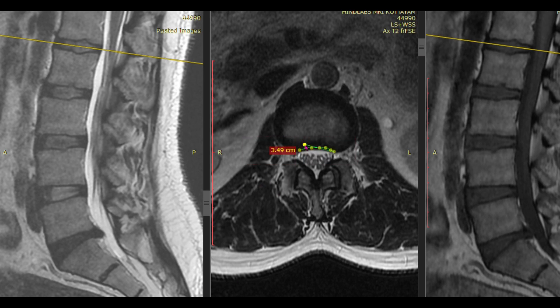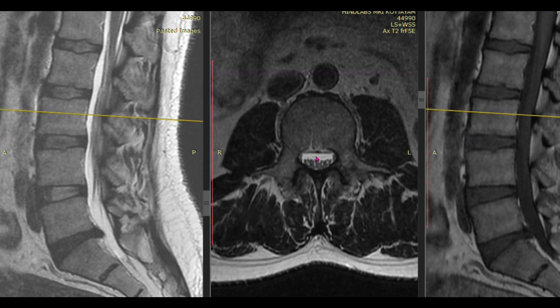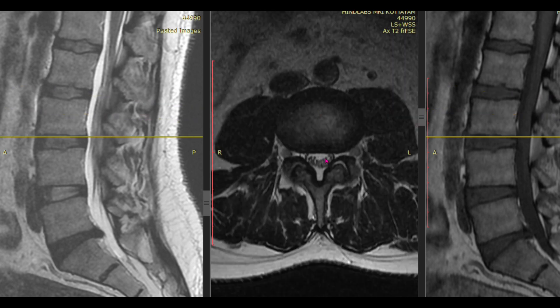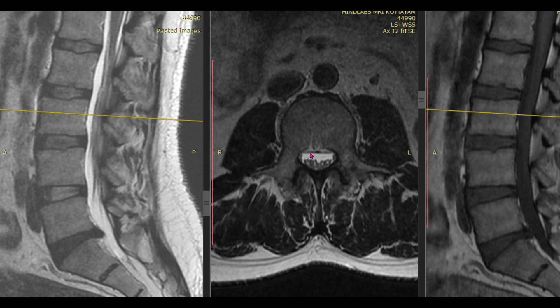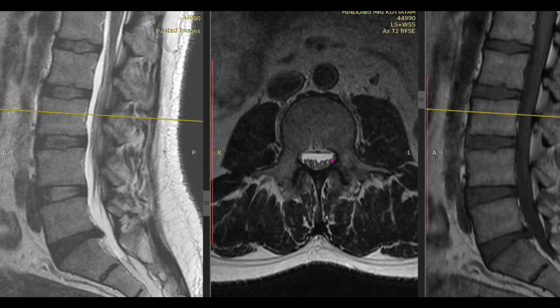Coming down, at this disc level — roughly L3-4 — you can see the disc is actually much bigger than the vertebral body outline of the level above. This signifies there is some disc bulge. In this case it is not focal but a diffuse disc bulge. Looking carefully, this diffuse disc bulge is indenting on the thecal sac — the anterior margin of the thecal sac — but it is not compressing the traversing nerve roots in the canal on either side.